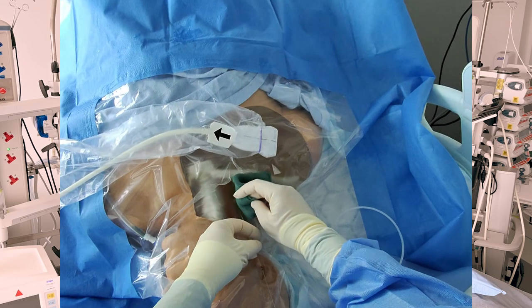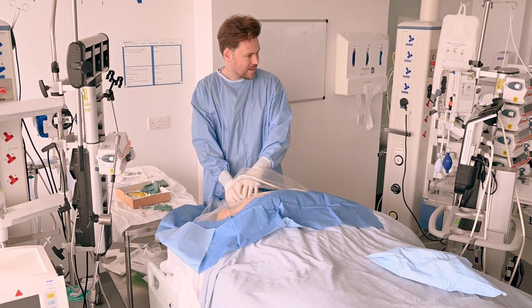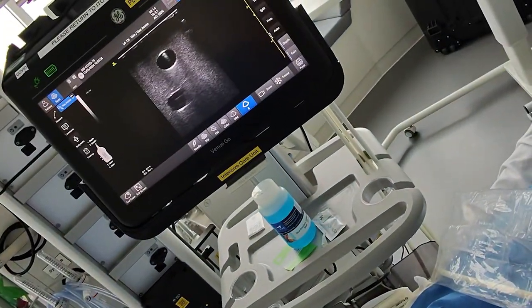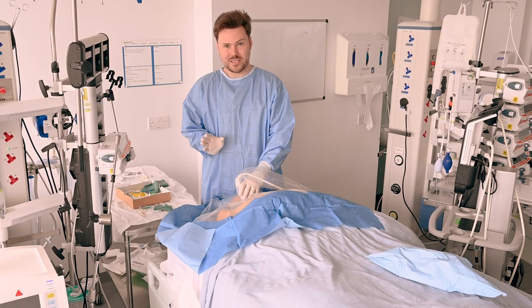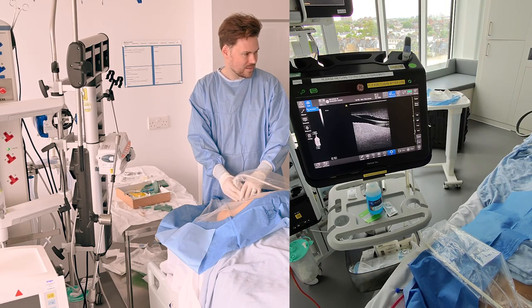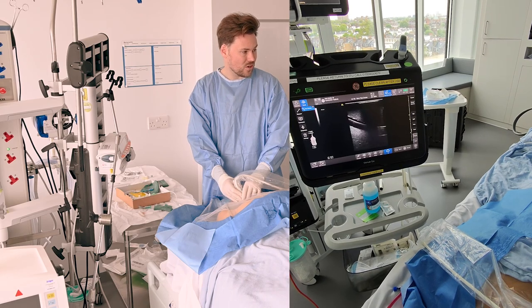I've got a decent amount of wire inside the vein now so I can withdraw my needle and get ready for the next step. With my guide wire in place, it's important to check with ultrasound to make sure that you're in the right vessel. Looking at the screen, I'm going to scan up and down and I can see the guide wire inside the vein as far as I'm able to see with my ultrasound. You can also look at this in plane — centering the vessel on my ultrasound screen, I'm going to rotate the probe through 90 degrees, and then with a small combination of tilt and movement I can confirm that I can see the wire both entering the vein and not exiting through the back wall, and I can track it along the length that I'm able to see.